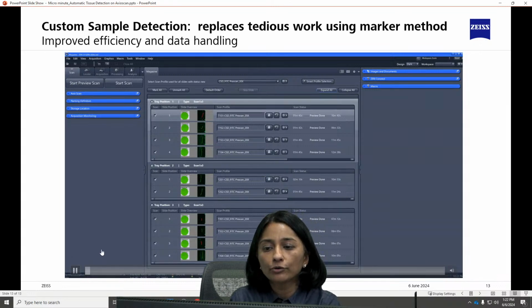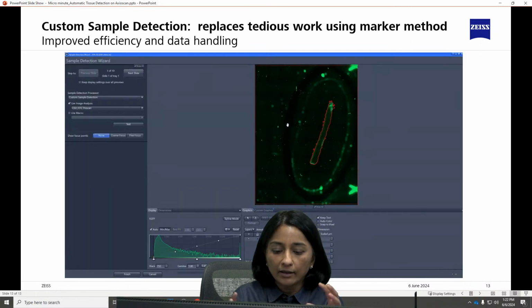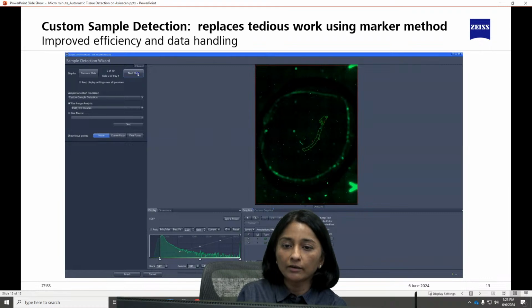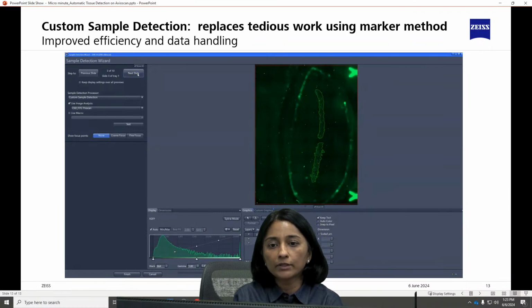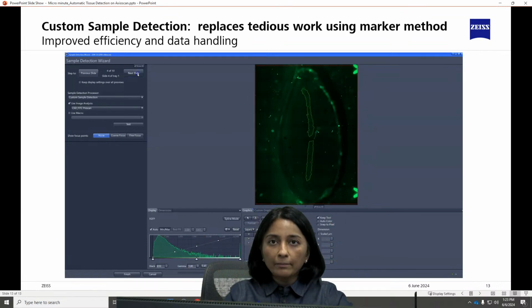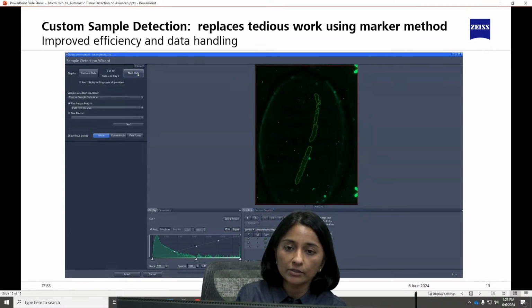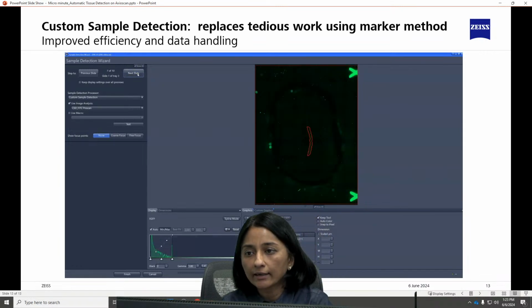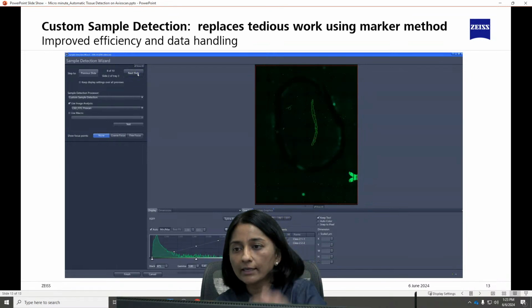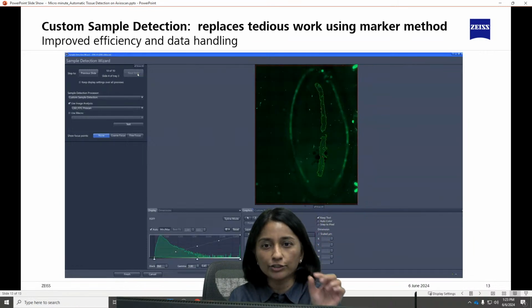So let me show you in this particular example where we have an image analysis setting based on machine learning. In this example, it was IntelliSys using the module. But what you see is the Sharpie in black around those tissue, but we utilized a fluorescence on these sections. And with that image analysis setting that you see utilized in the sample detection wizard, we were able to just delineate just the tissue.